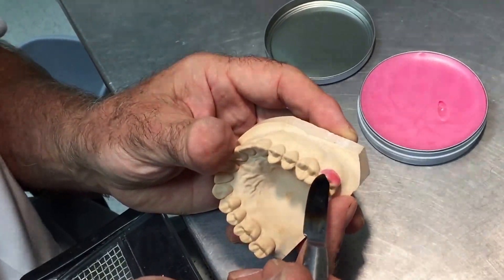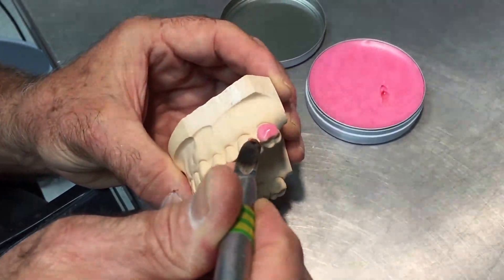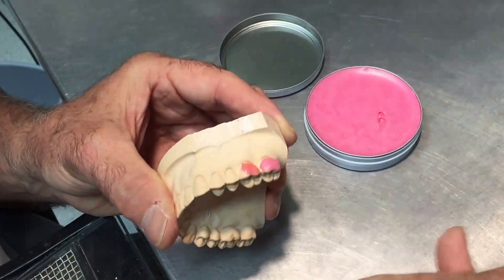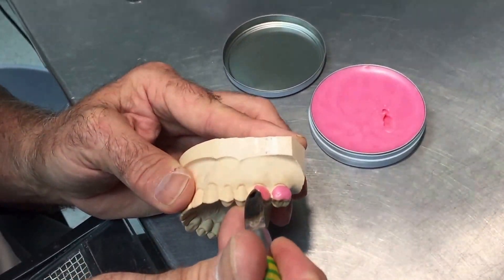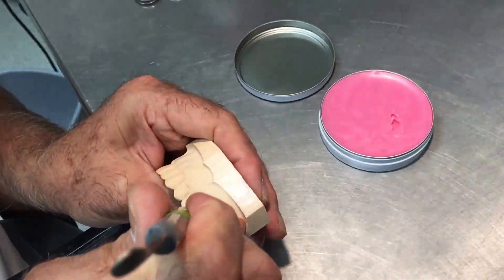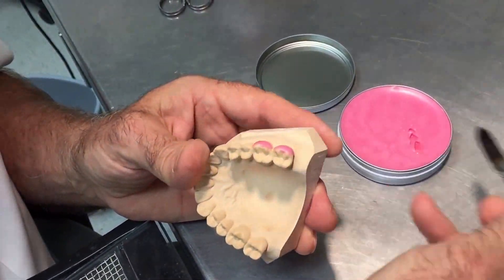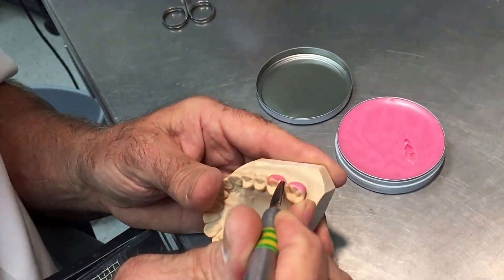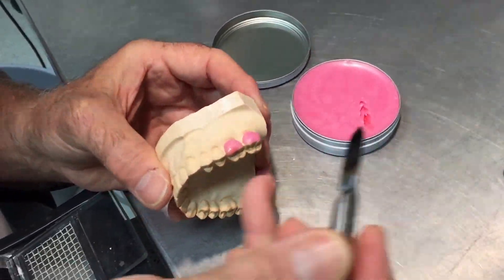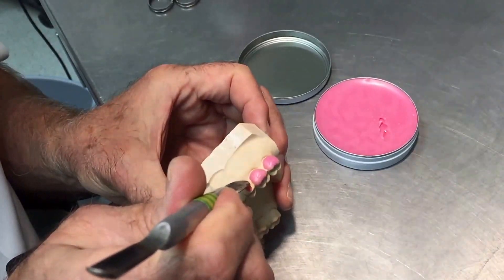You can see how I've just carried it over the incisal area. That's an assessment made by you and the patient as to how far you carry over — on some anterior teeth you might want to carry it further over the incisal if there's incisal staining. What we're trying to do is provide a reservoir of the chemical, about a millimeter or a millimeter and a half thick, so it remains active for longer just with the action of the lip while the patient's wearing this.